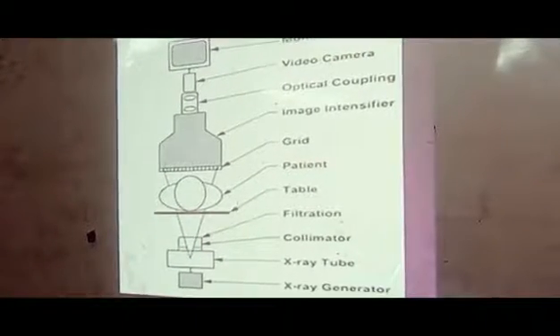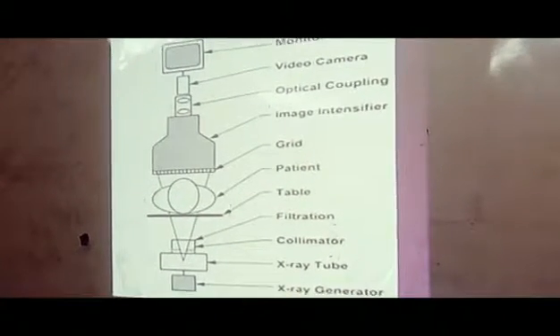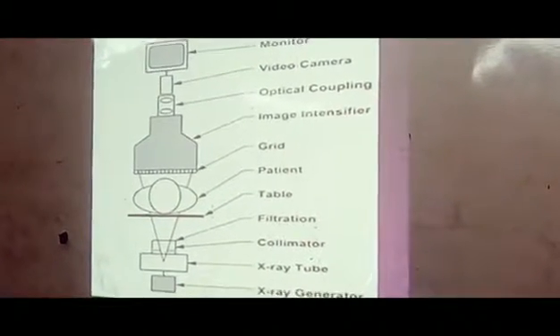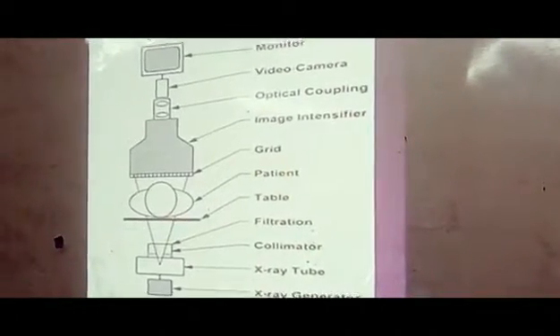The collimation. Shutters that limit the geometric extent of the X-ray field are present in all X-ray equipment. In fluoroscopy, the collimation may be circular or rectangular in shape, matching the shape of the image receptor.